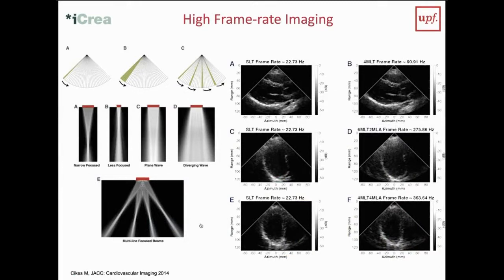One of the things I said before is that ultrasound imaging is more or less real time. But still, in order to really look at these details, we would like to have faster imaging. And in order to do full 3D imaging, we also would like faster imaging. So nowadays there's quite a lot of research in trying to do ultrasound differently. For example, you can start to shape the beams that you're using.